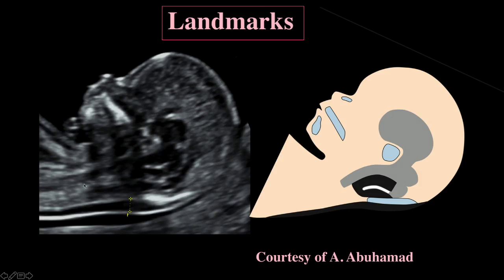So the perfect nuchal translucency, so to speak, is shown here where you have the nasal bone, the palate, and the intracranial lucency, which is really the fourth ventricle right here. And you can see these areas also on the schematic next to it. This is really the minimum that you should do as far as looking at the face in profile. You've got the chin there, you've got the forehead, the relationship between the forehead and the chin, and so forth.